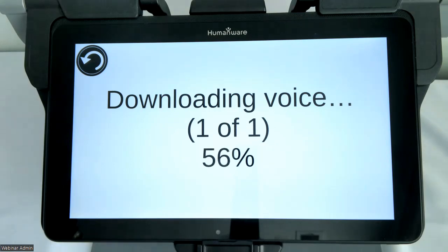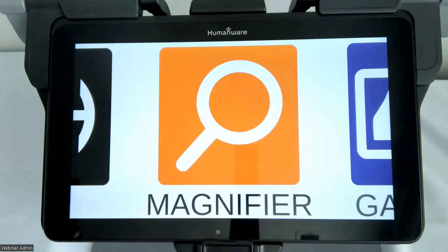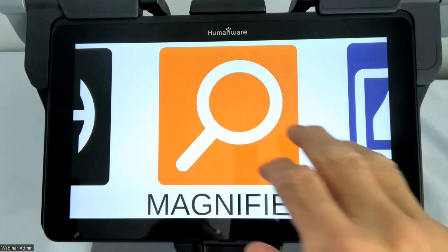So this student user will have their own instance of Prodigy where anything that they change in terms of settings and so forth will be retained there. So we'll get this installed and updated. Okay, so our license check and so forth have completed. We are in the student account now. It's finished the setup of Prodigy and so forth.